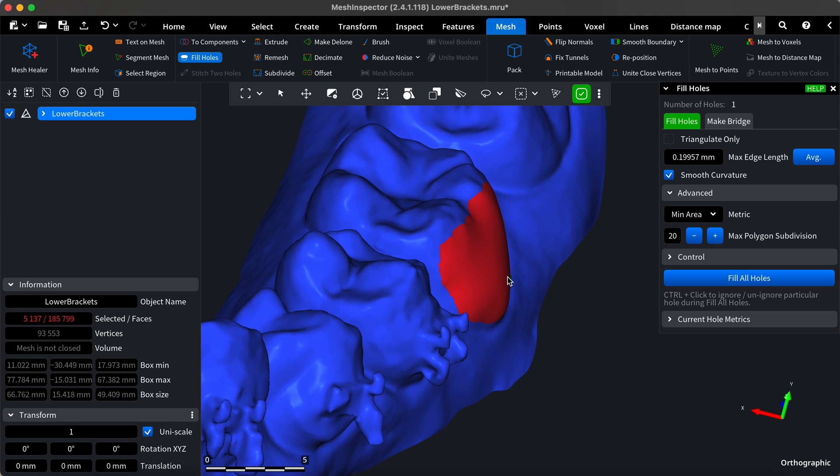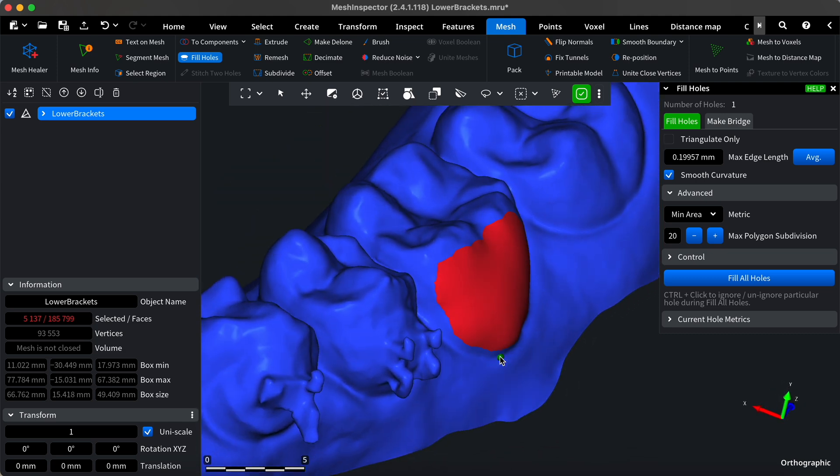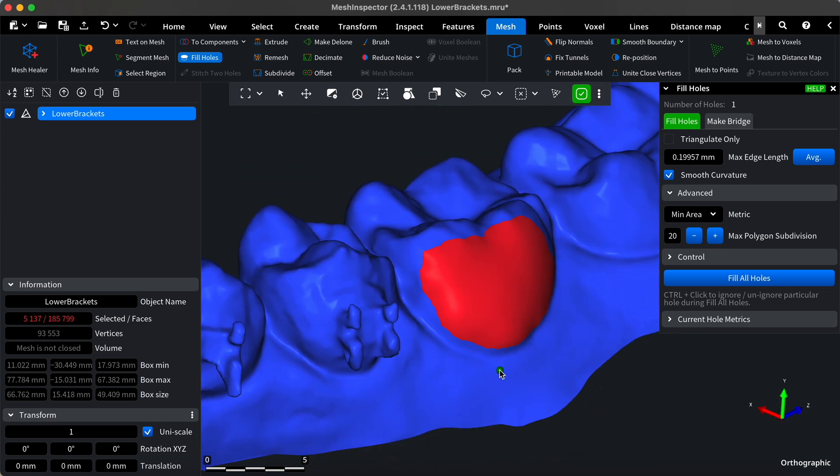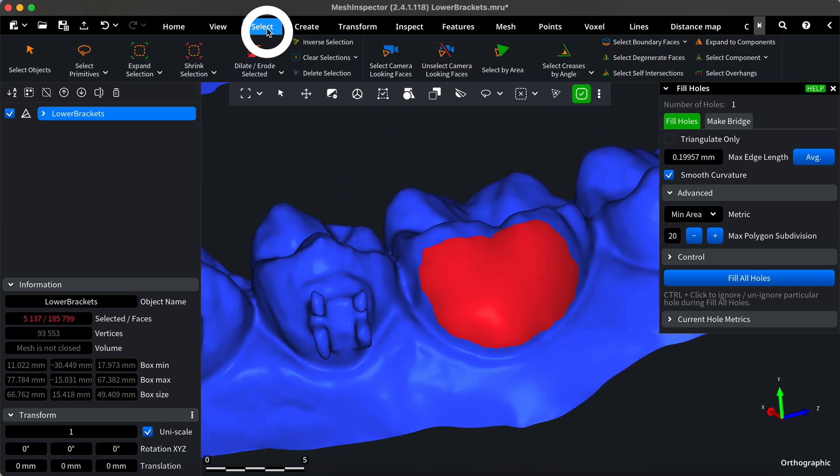Depending on the final look you want to achieve, your model may require some refinement. To make the filled hole look more natural, first, expand your selection a little bit.